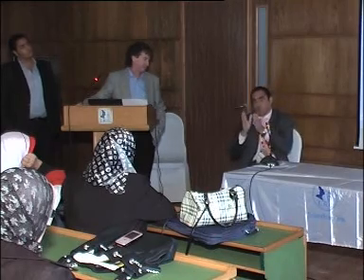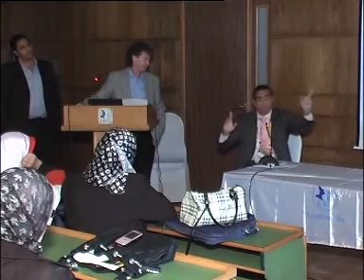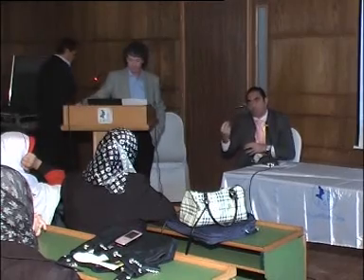So what you do is, even if you have a CT with a lot of fluid, and correct me if I'm wrong, Dr. Philippe, either you put the needle in and slowly drain the fluid and wait for pneumothorax, and the next day repeat your X-ray before you go in smoothly, or you can do ultrasound, and they can tell you that there are no adhesions. And be careful, because if you go immediately with the thoracoscope, you can get re-expansion pulmonary edema if all the fluid comes out immediately. So let's all correct what we're doing, even if we were doing it wrongly in the beginning.